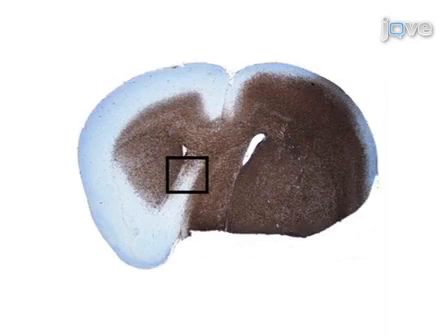Here, a section of the paraffin-embedded mouse brain is shown. EGFR inhibitor-sensitive brain tumour cells can be identified by the brown EGFR staining.